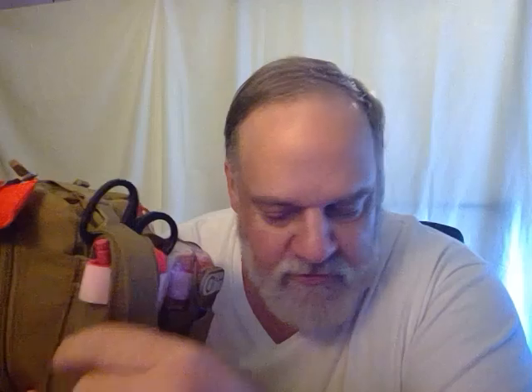Right off the bat, you see I have my O positive blood type, if somebody needs to know that. I keep 3 tourniquets on the outside with a pack with one pair of shears on it. That's what's on the outside, and a CPR face shield, if somebody's concerned about who they've had to team up with, that kind of thing.